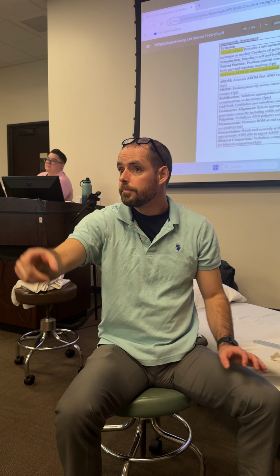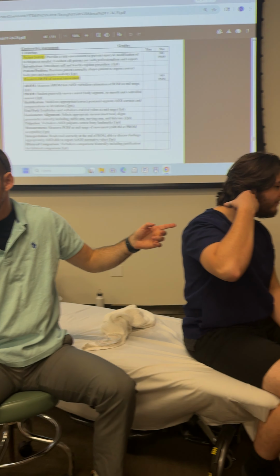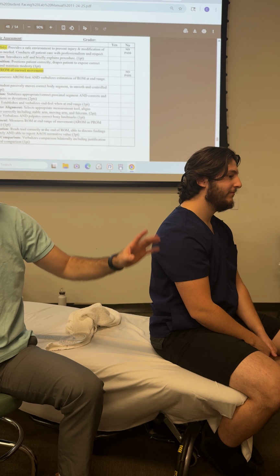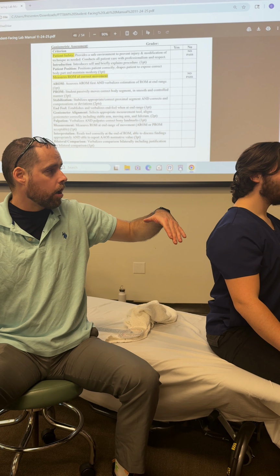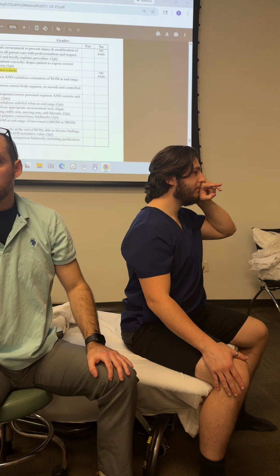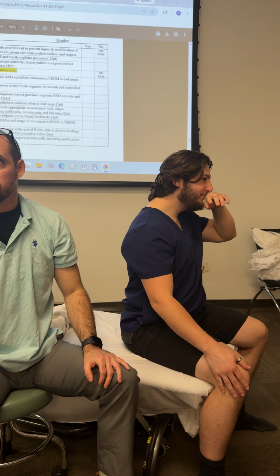Can you just repeat, sorry, the landmarks again? The external auditory meatus is going to be the axis. I don't need to give him a wet willy to do it and palpate, but if he wants to do it to himself, that's fine. Perpendicular to the ground, which should be parallel to the thorax if he's sitting in good posture, is the stationary arm, and then the moving arm is parallel to the inferior line of the nose. If your patient's nose is offset up or down, then try to just treat it as if it wasn't.